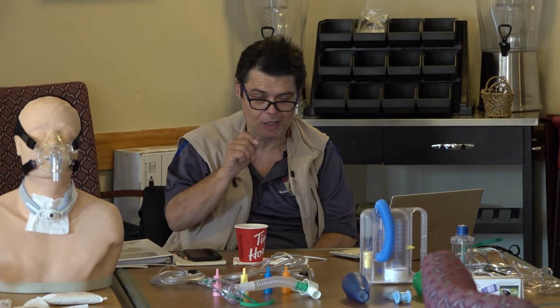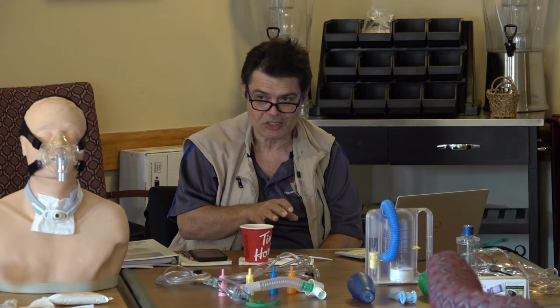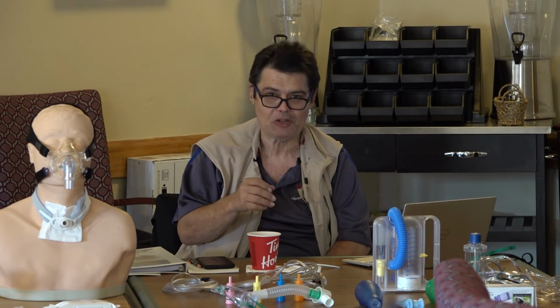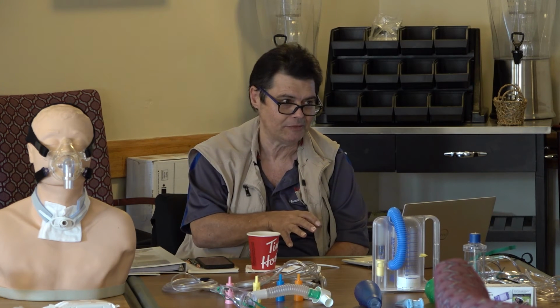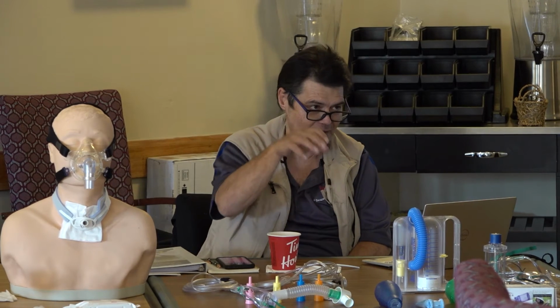So everybody understand that? Again, the cheat sheet will help you in the middle of the night or if you're unsure. Also keep in mind, your trach patients will not come in with a liter per minute order. You need an FiO2 order. In the hospital they'll tell you a patient is on 10 liters per minute, but 10 liters per minute is meaningless. What's the FiO2 requirement? Because 10 liters per minute here would be 60%. So we need to make sure that we can meet that 60% requirement in the facility, right?